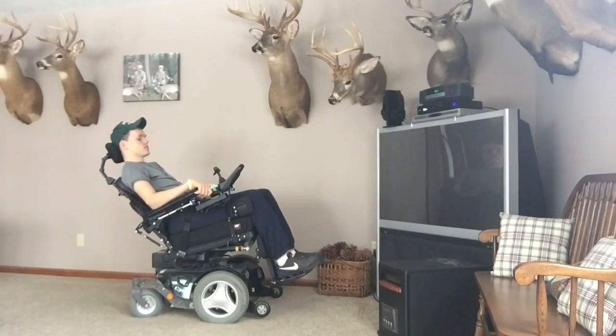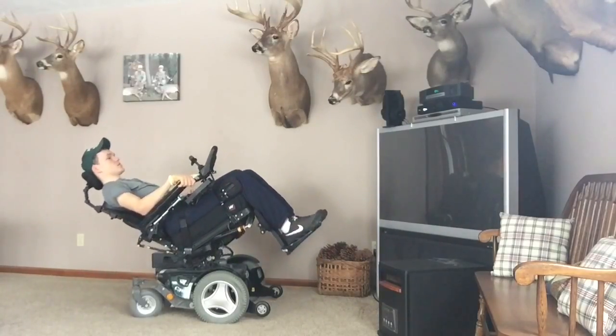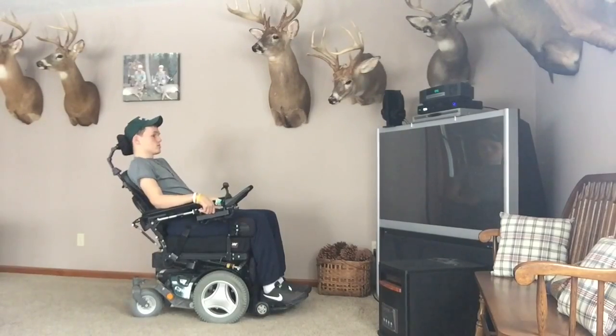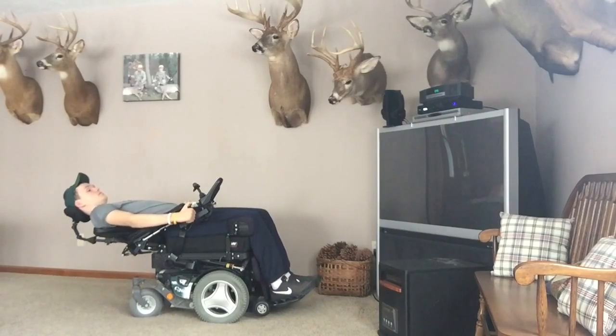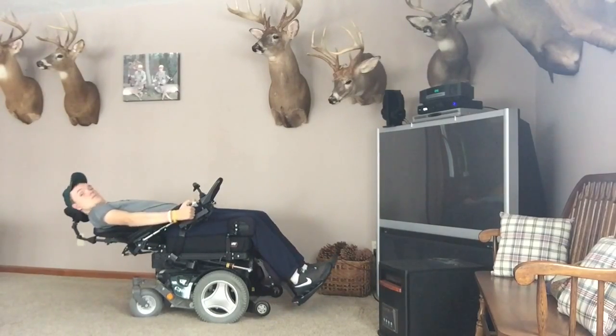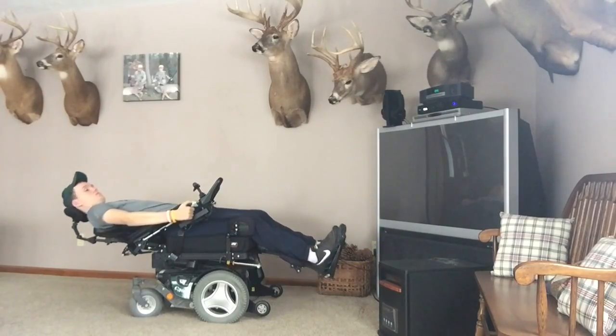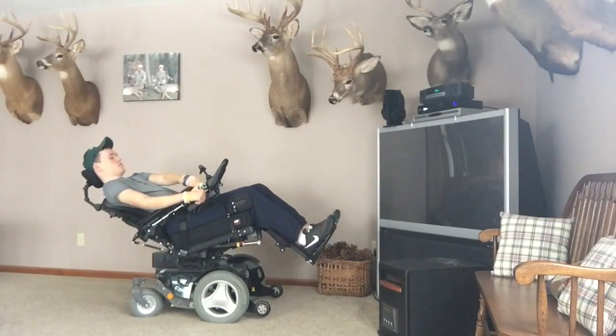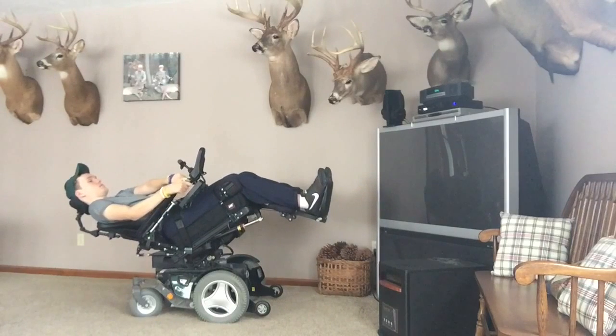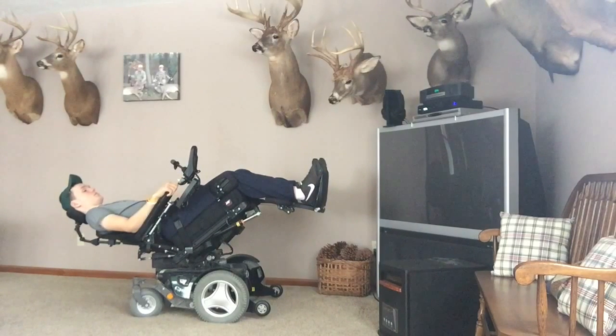Most power wheelchairs have a tilt feature, which you are seeing here, as well as a recline feature. Elevating the leg rests can also help in pressure relief, but if you combine all three of these, you will get the most benefit. When doing these types of pressure reliefs in a power chair, you want to make sure you are on level ground, and also you want to be careful of spasms, because I know I have spasms when I do this.